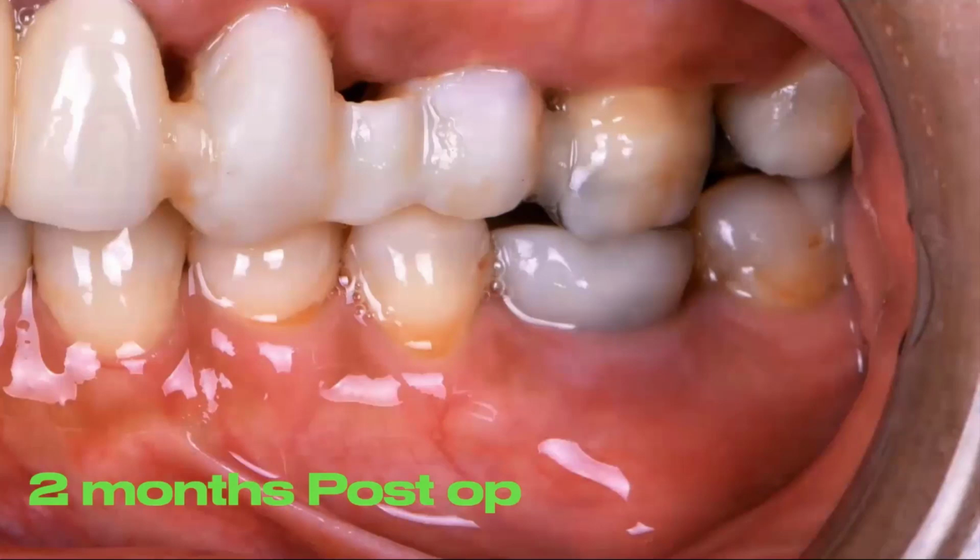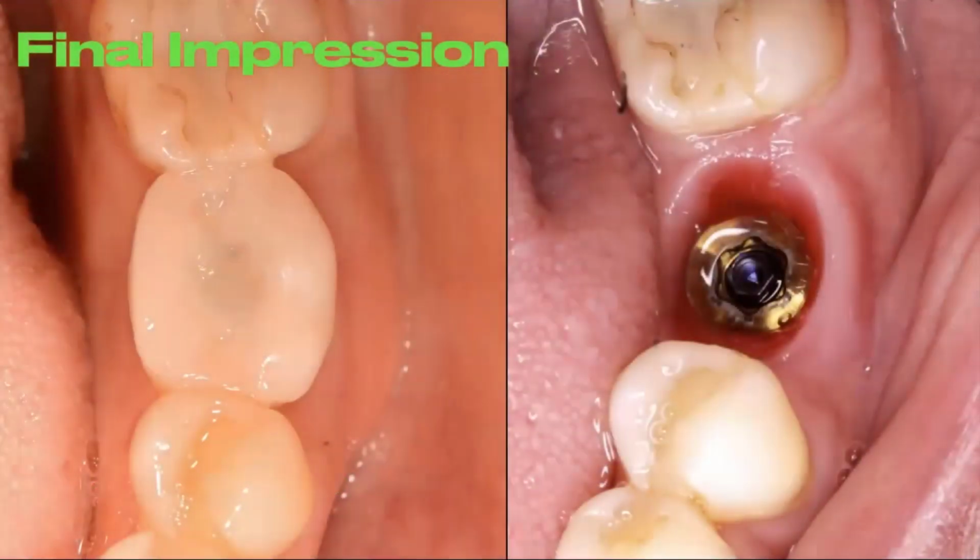You can see we started to work on the top here as well to try to help things out. And that allows us then to take a final impression. Now, when you take a final impression of a case like this, and you can imagine the surgery was done guided in the sense that it was driven by cone beam CT. The placement was guided through the 3D printed scan guide.